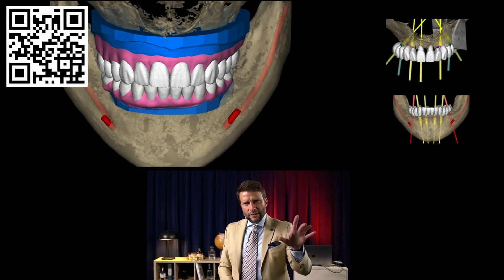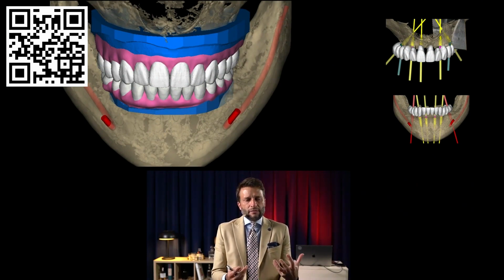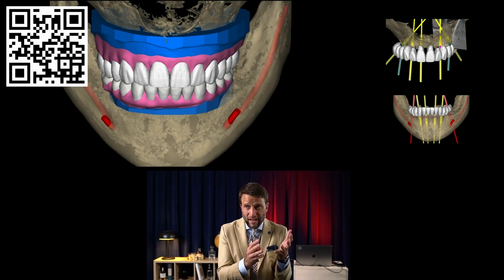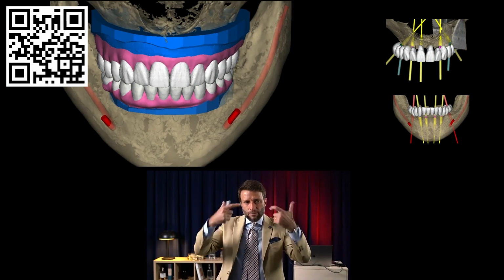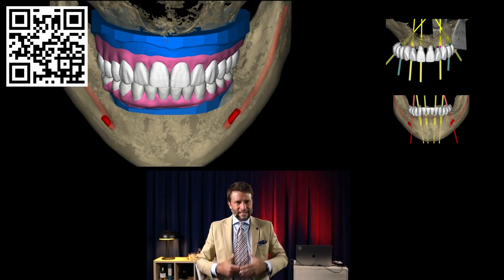Now, not only that, because as a dentist, I get really excited about what I'm seeing here. We do this every day. We see opinions changing because of this technology. We see plans being improved because of this technology. So I get emotional about this. I get excited about this.